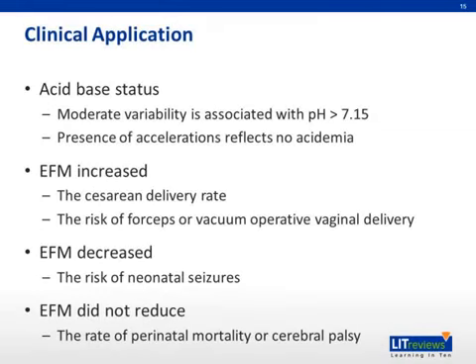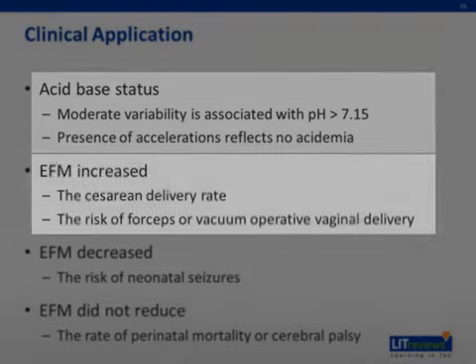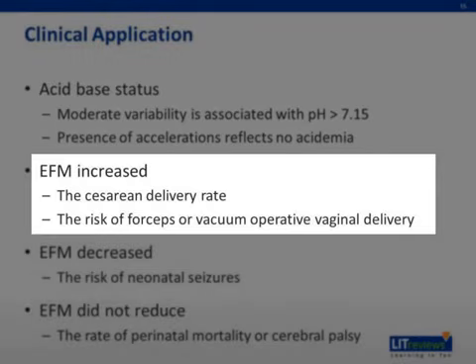Next, I'd like to review the clinical applications of electronic fetal heart rate monitoring. Moderate variability is associated with a pH of greater than 7.15. The presence of accelerations reflects no fetal acidemia. Electronic fetal monitoring increased the cesarean delivery rate, and the indication for cesarean deliveries was for abnormal fetal heart rate tracings and concern for acidemia.